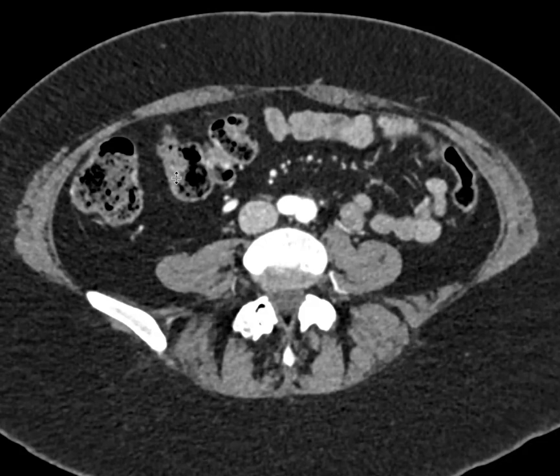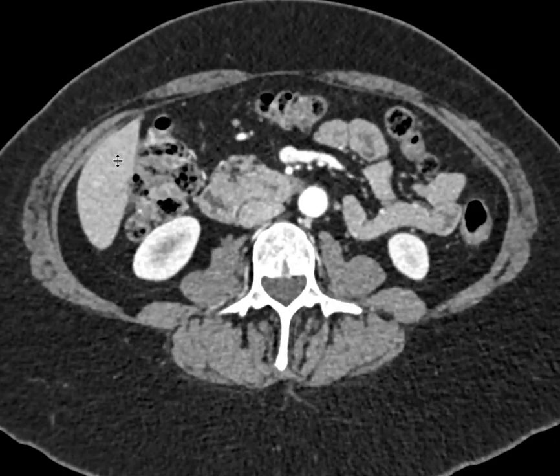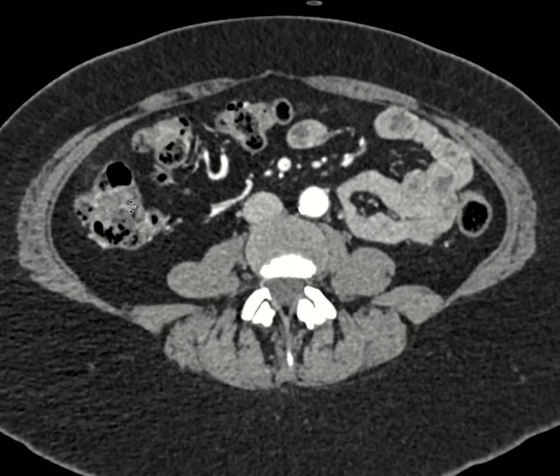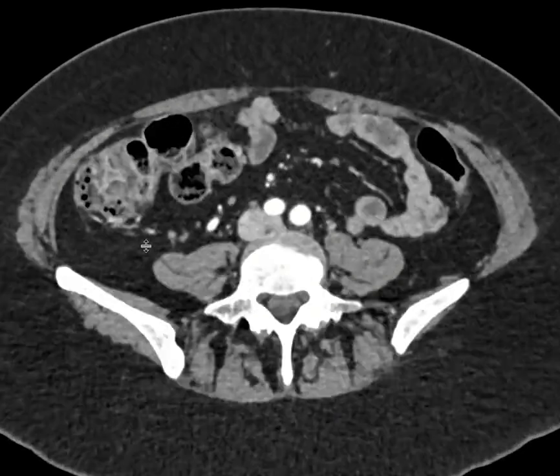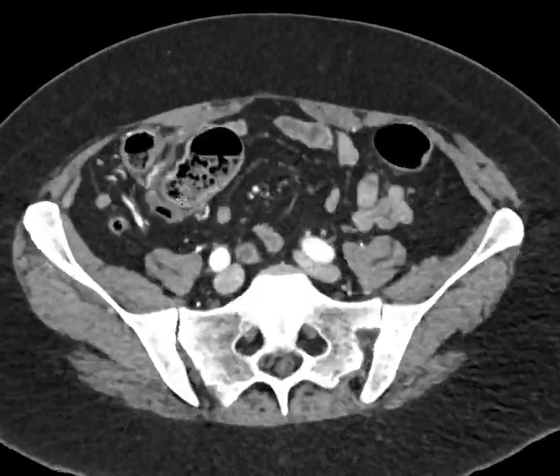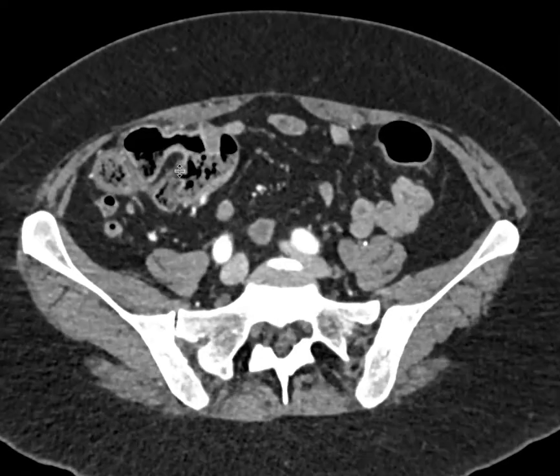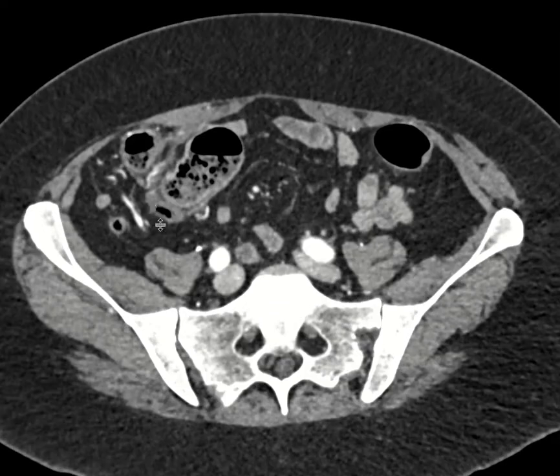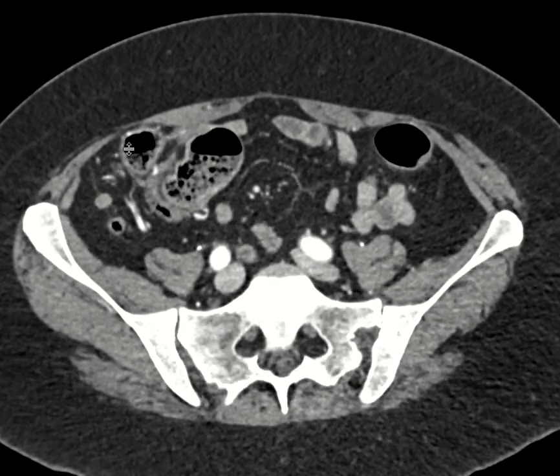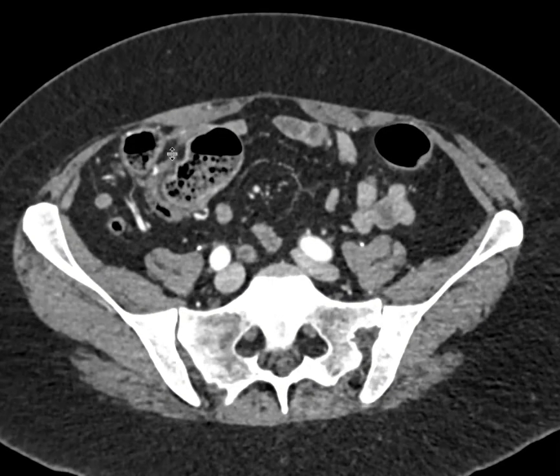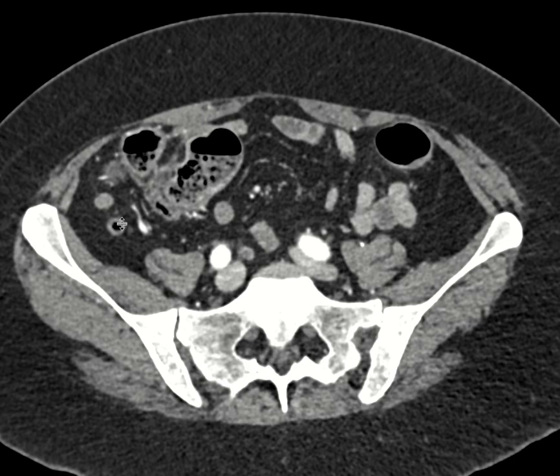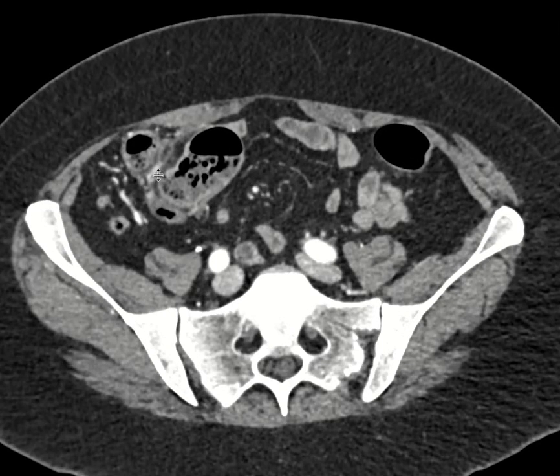Our transverse colon is going to go up around the liver here, so here's your hepatic flexure, and then you have your right colon. You follow the right colon down, and usually what becomes fairly easily visualized is your ileocecal valve, because you have some invagination of fat in here — and so this is your ileocecal valve. Usually your ileocecal valve is on the medial aspect; in this particular patient, it is on the lateral aspect.